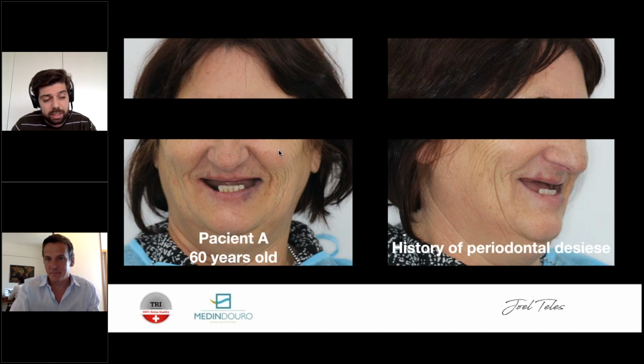But in the worst case scenario, I cannot get more than 20. I have the other three with torque. I would load that implant as well. The main risk I'm taking is that it will not integrate. If it will not integrate, I will have the other three integrated then, and my treatment timeline will be bigger because I will have to place another one in that scenario.